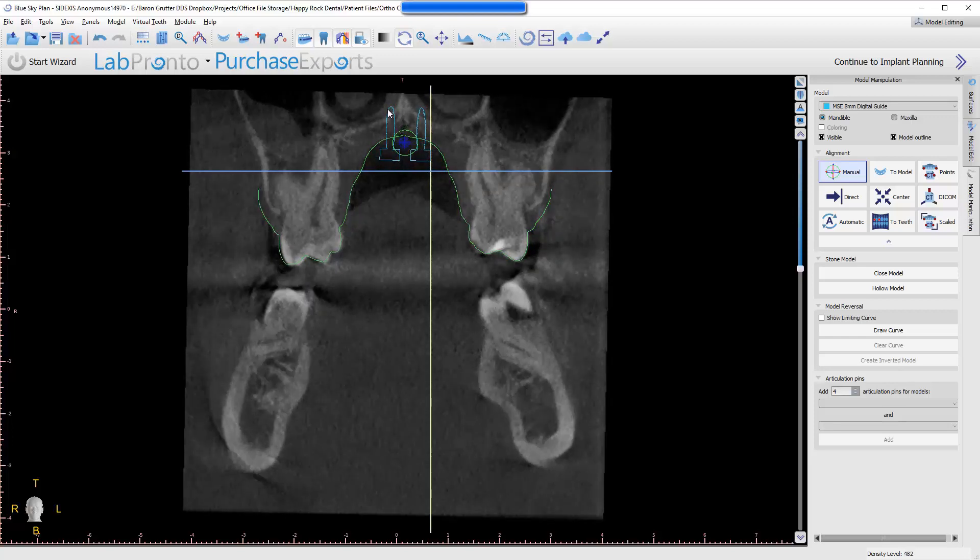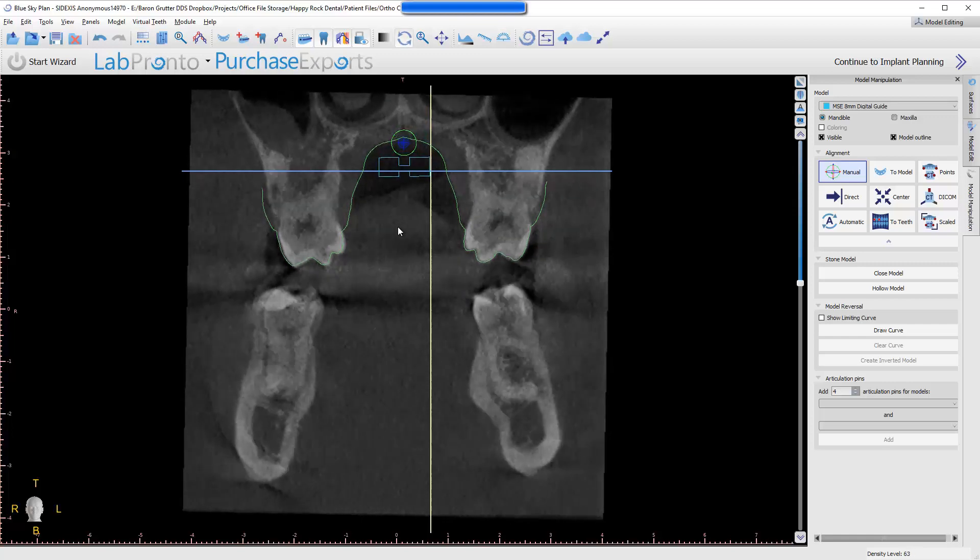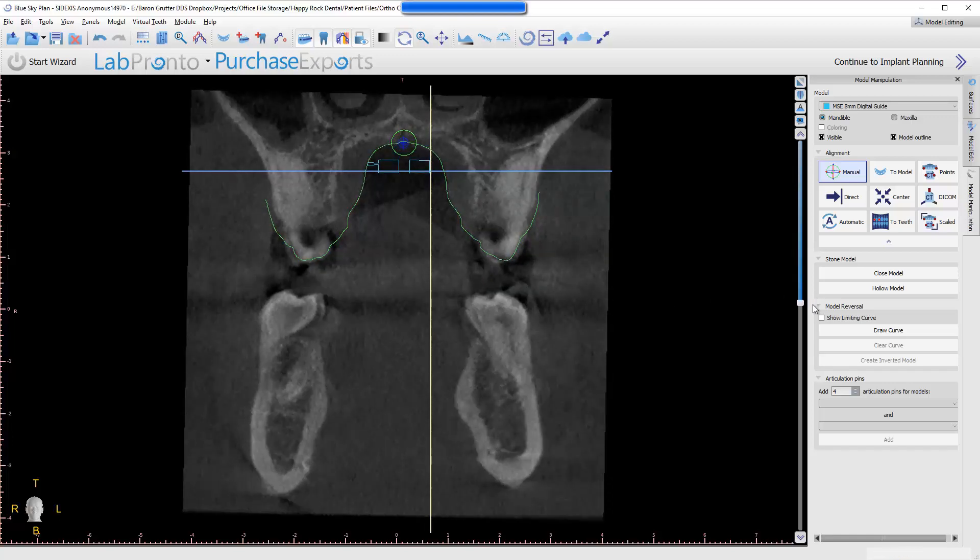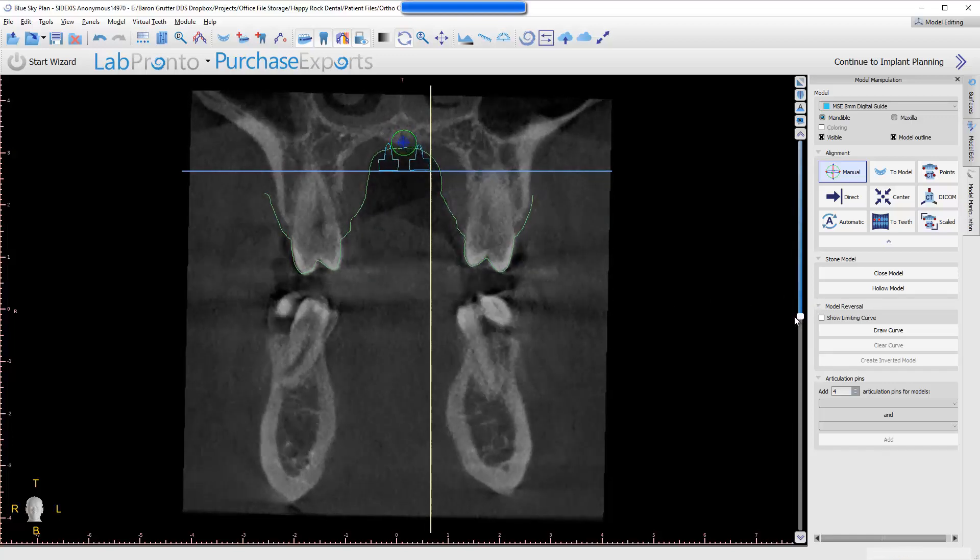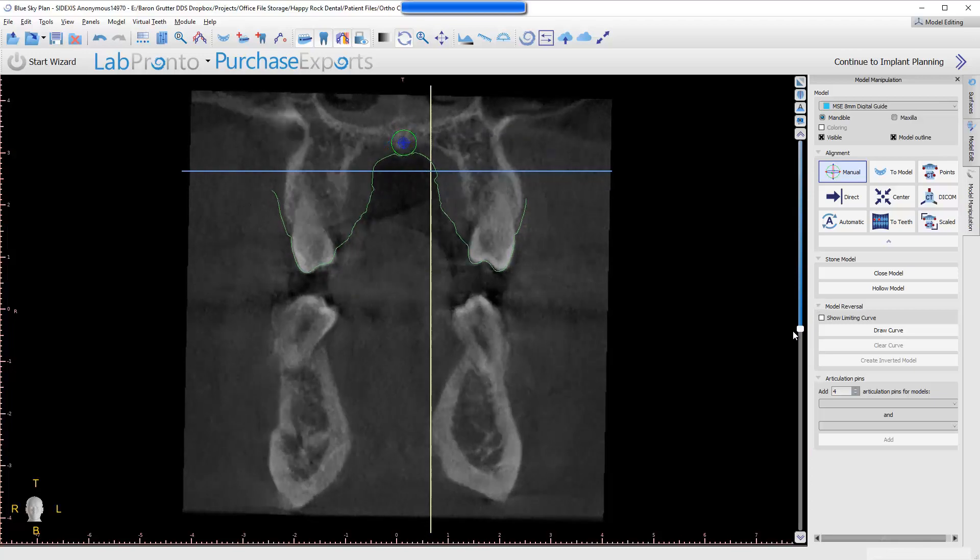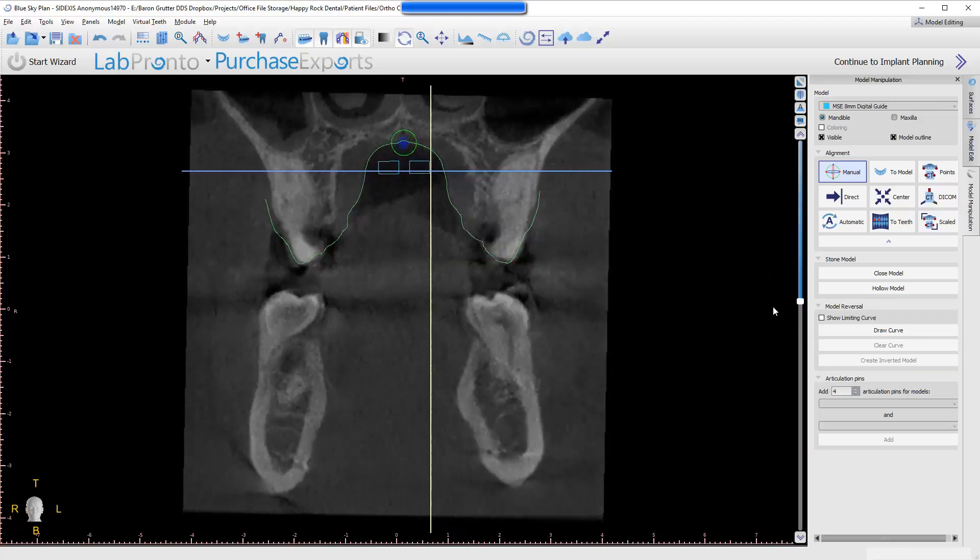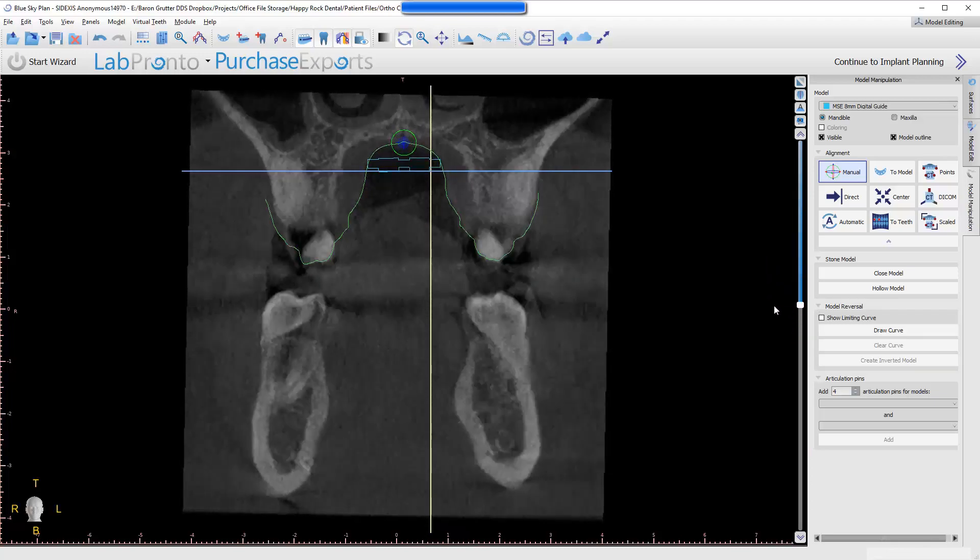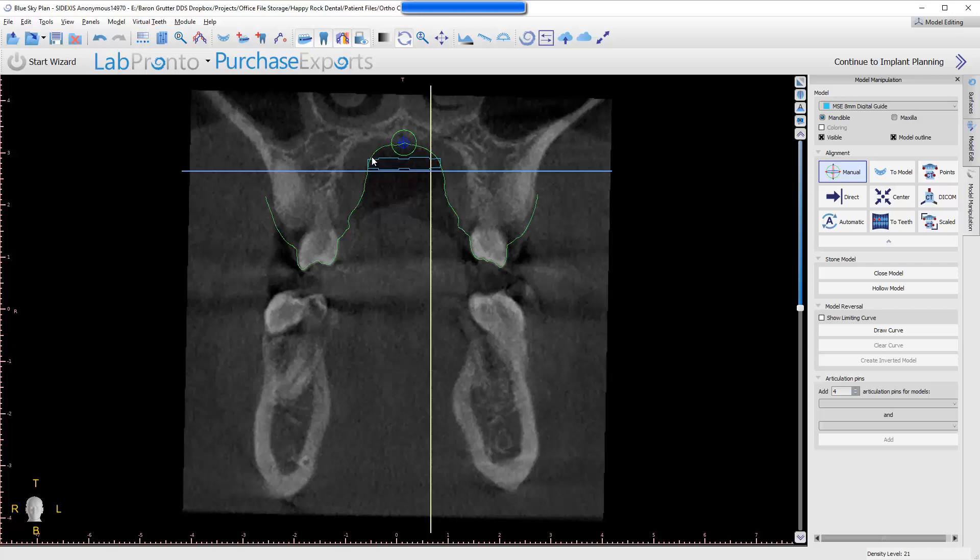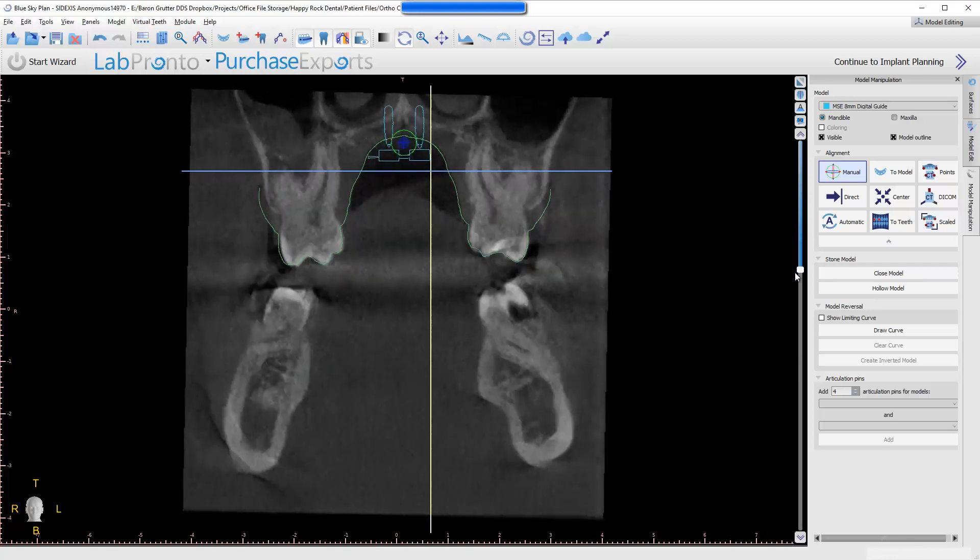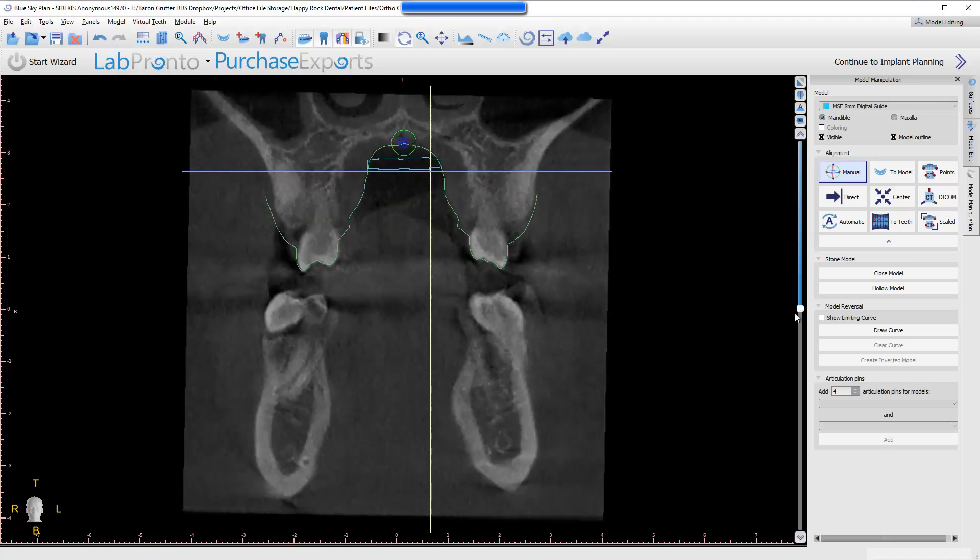You can also evaluate, up in this view, the suture itself. Now, I'm in a limited field of view CT, so it stops up here. It's fine, but you can see where his suture has not fully formed yet, or is not fully densified. I can also say it's a little bit leaning this way, so let me go ahead and turn this. And if it becomes too finicky, just hold your mouse, drag out away, and you can be a little bit more fine-tuned in your movements. Now, I'm going to left-click, slide it over, and now we are as centered. You can use this as well, or your wheel on your mouse, and say that I'm engaged in pretty good bone from here on through. This is the greatest amount of impedance of the pins, is right here. You could ask the tech to either go ahead and shave these if you want. Probably wouldn't even matter because you've got plenty of soft tissue to engage there.